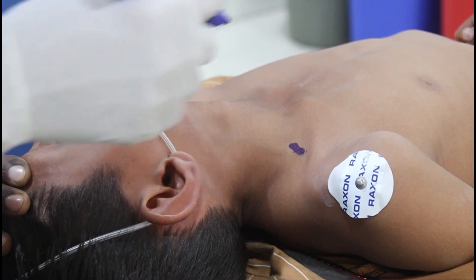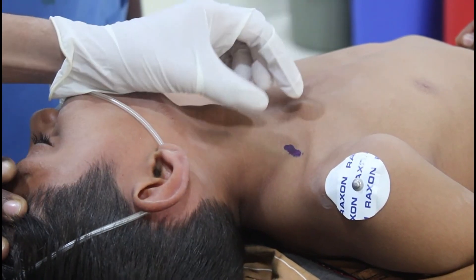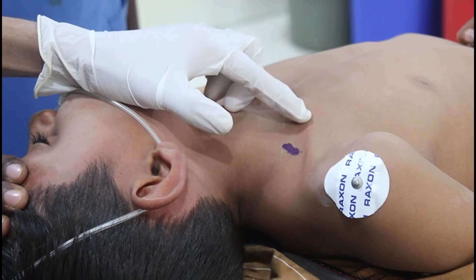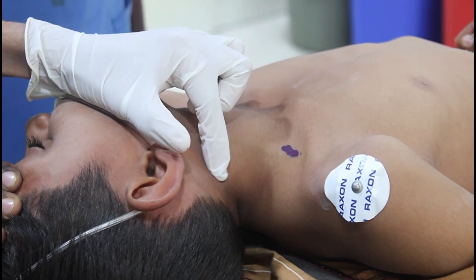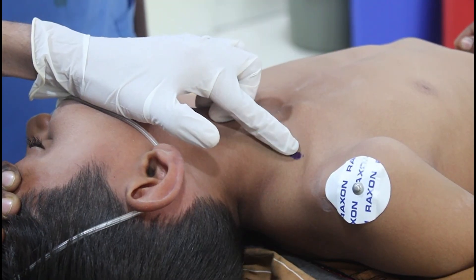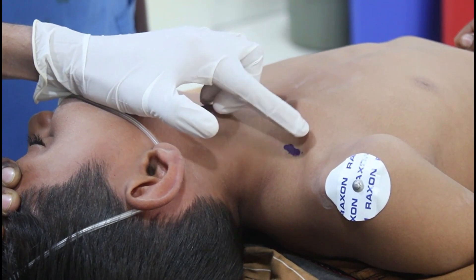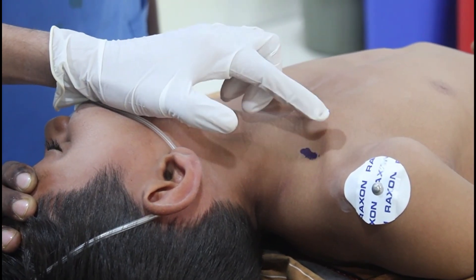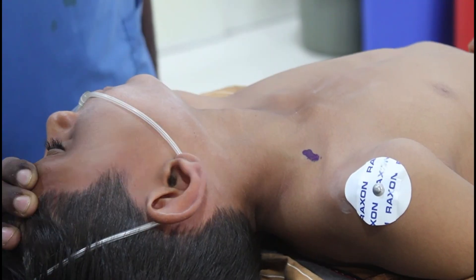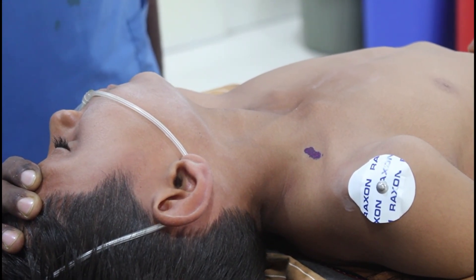If I want to get the pulsation of the subclavian artery, the second landmark will be to draw a line from the lateral border of the clavicular head of the sternocleidomastoid muscle, and just 2 to 2.5 cm lateral to that border and 1 cm above the clavicle — that will be the entry point for the supraclavicular block. Now I will give a PNS-guided supraclavicular brachial plexus block.